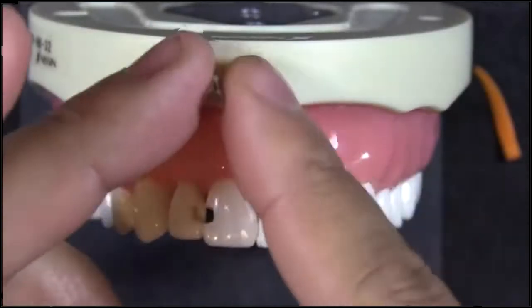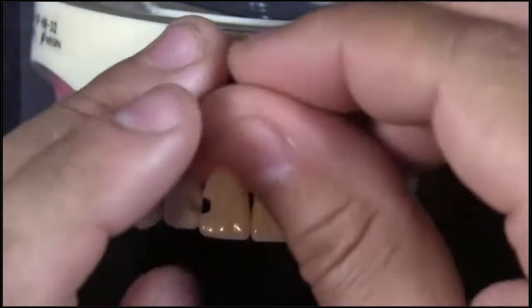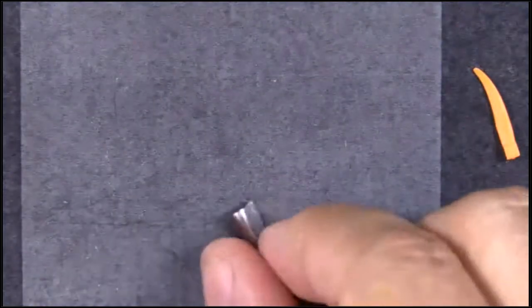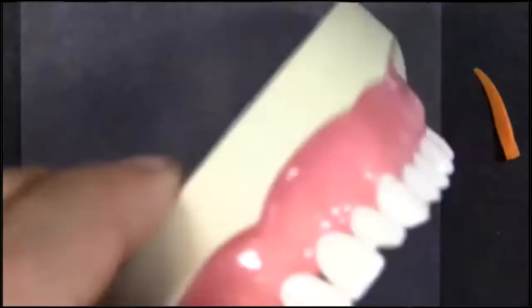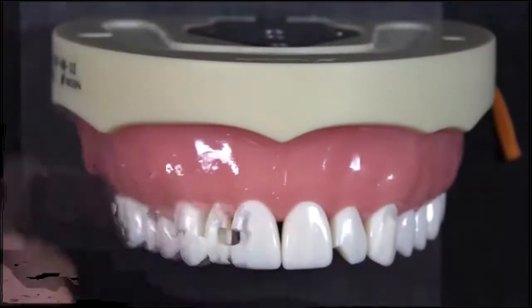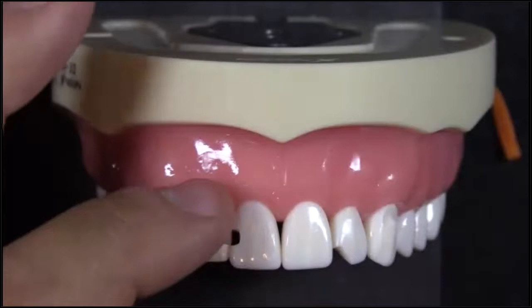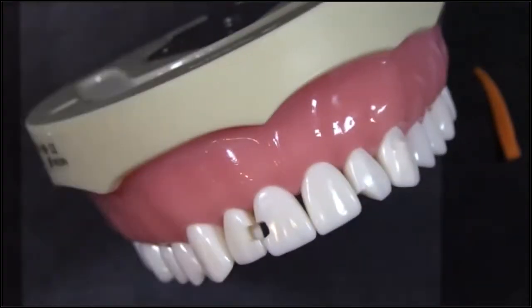Here you've got this wedge or curved shape band, and it's got a unique shape. You can see it's tapered, thinner on one end, thicker on the other end. I like to place the thicker end towards the restoration. When the restoration is right in the middle of the tooth, you can do it either way. You're going to get the same results. If you're closer to being subgingival, I like to place the thicker portion towards the gingiva. If it's closer to the incisal edge, like a class 4, I like to flip it around.